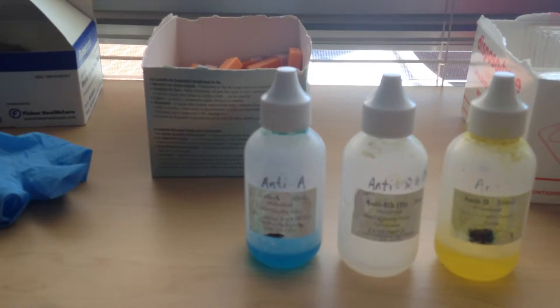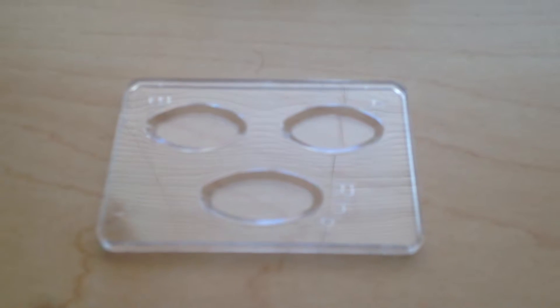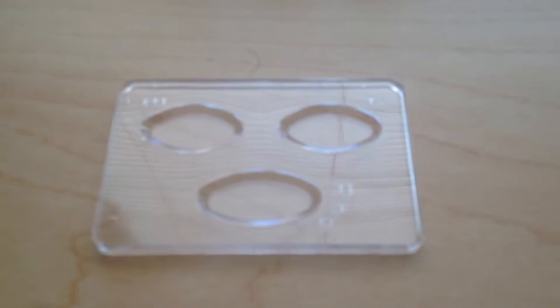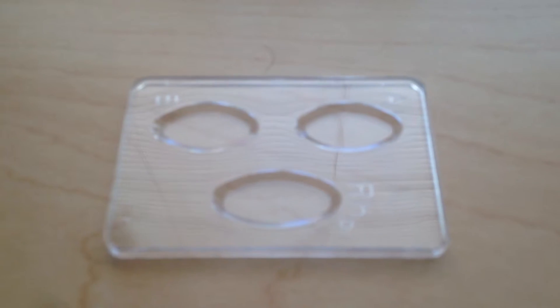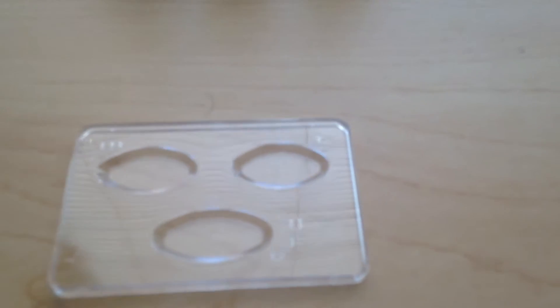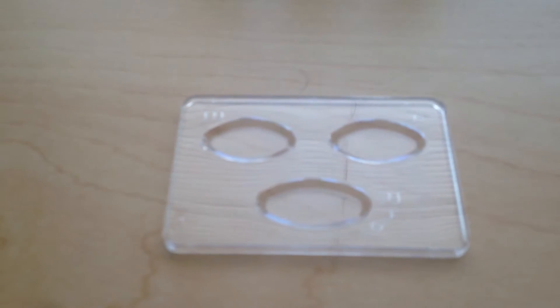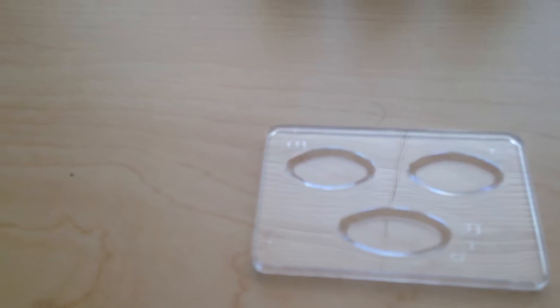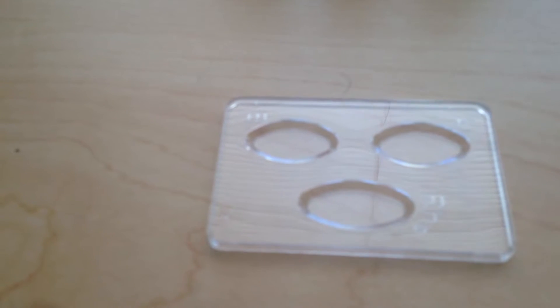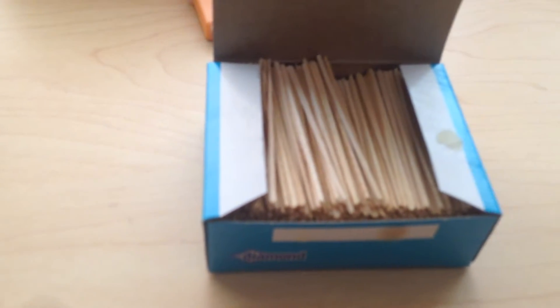For blood typing you also need the plastic container — it has three wells — and you put three drops of blood, one in each of those three places. You also need sticks to mix the blood with the serum. These toothpicks are used to mix the serum with the blood.